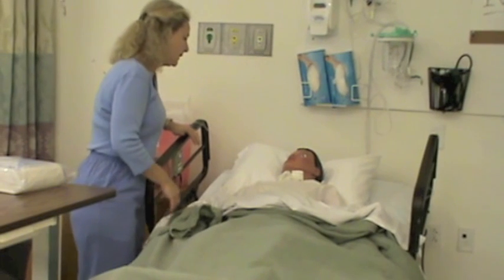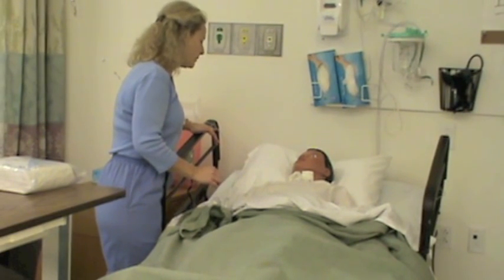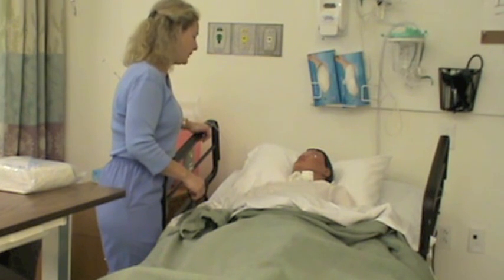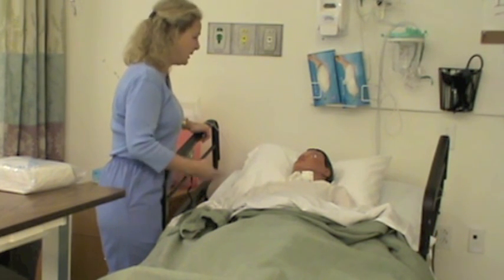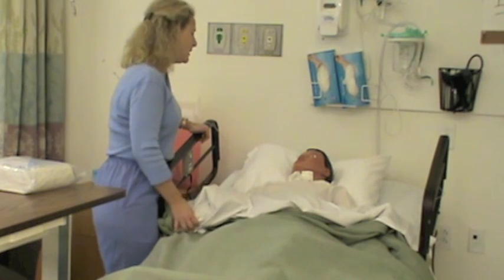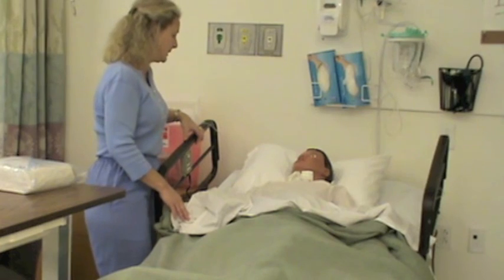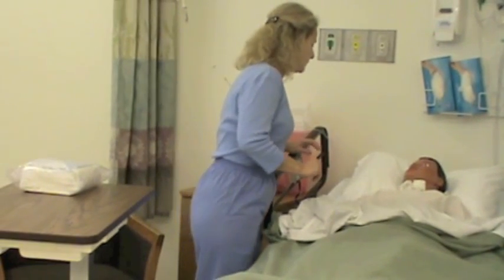What I'm going to be doing is inserting this catheter. It's like a little tube that's going to go through your urethra and sit in the bladder and continually drain your urine. The doctor ordered that so that we can measure your output very carefully and you don't have to strain to get up into the bathroom and use too much oxygen by doing those activities. You may feel a little bit of pressure. You may feel a little bit of pressure — no, it's not going to hurt, just a little pressure on insertion.